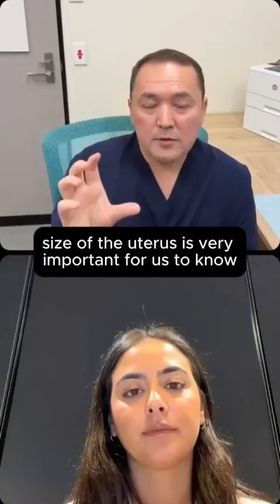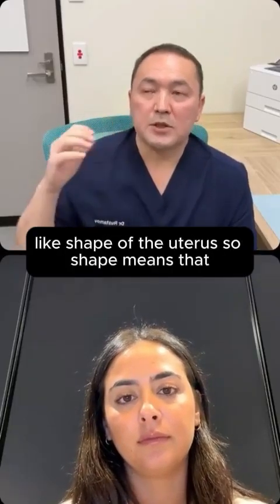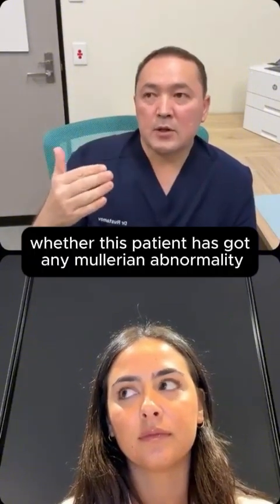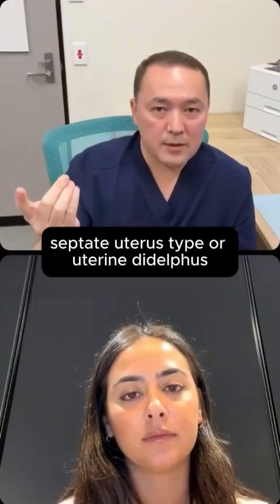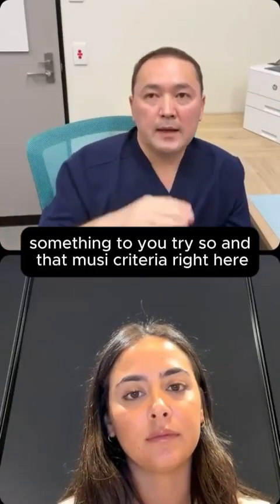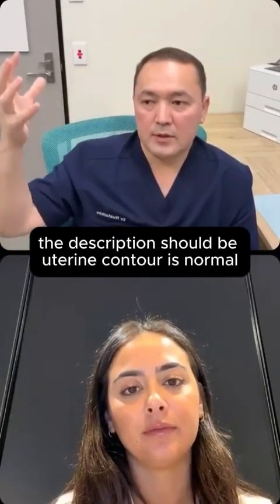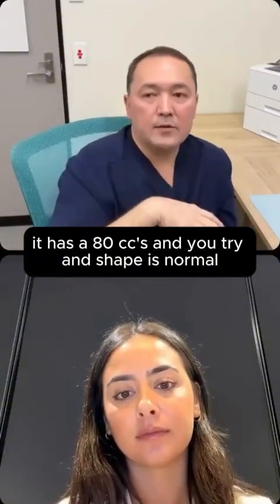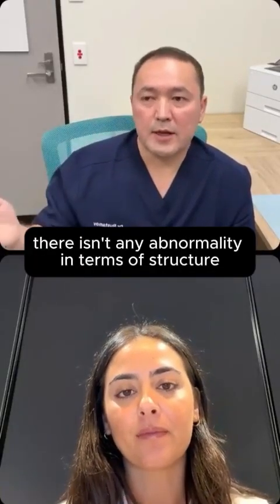So the size of the uterus is very important for us to know, and also the structure of the uterus, like the shape. Shape means whether this patient has any Mullerian abnormality, like bicornuate uterus, arcuate uterus, septate uterus, or uterine didelphys, having two uteri. In the MUSA criteria, the description should be: uterine contour is normal, the size is, let us say, 80 cc's, and uterine shape is normal. There isn't any abnormality in terms of structure.